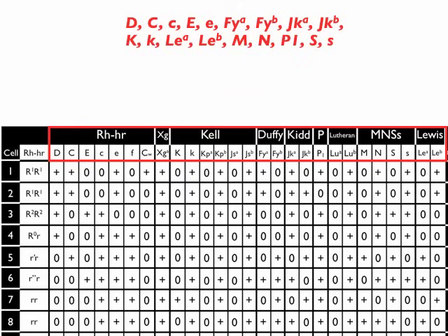and some of those are generally completely insignificant, such as Lewis A, Lewis B, M, N, and P antibodies. But that being said, they are required to be there, and you'll see them on the panel down below. In addition, most panels will have some additional antigens that don't necessarily make a lot of difference and aren't necessarily all that important, but they are there.